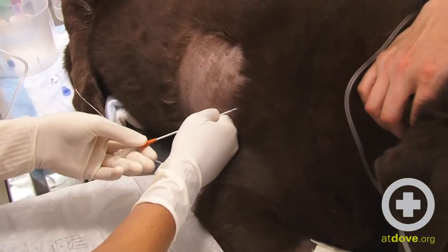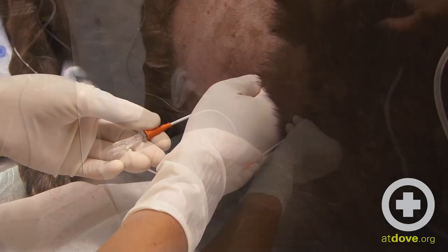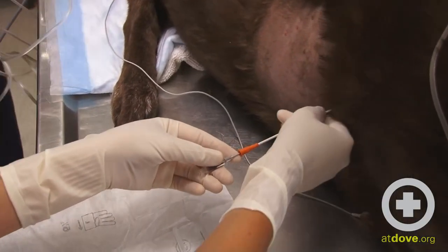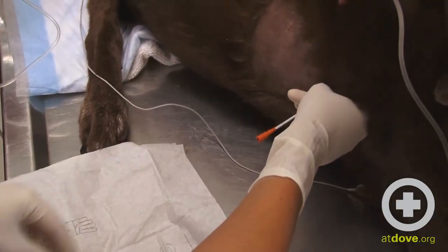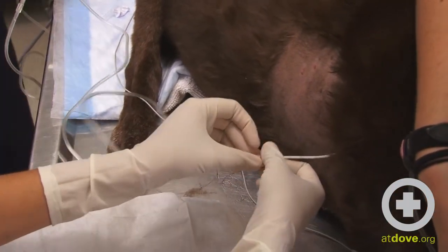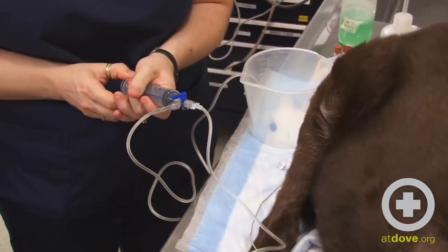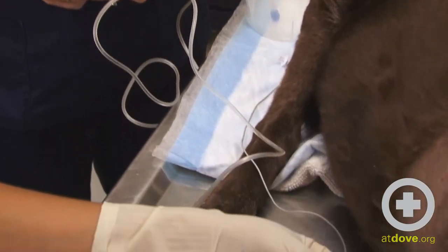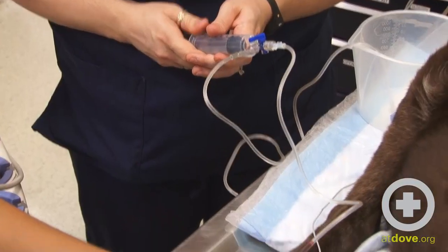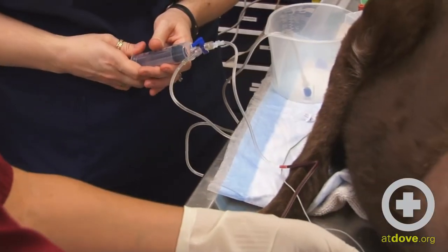You're going to advance the catheter and look for blood in the hub. So you advance, you get blood in the hub, you immediately advance it. Attach the hub of your needle to your catheter and then you try to withdraw. It may not work right away, and it won't necessarily come very fast. The goal is just to be slow and steady.